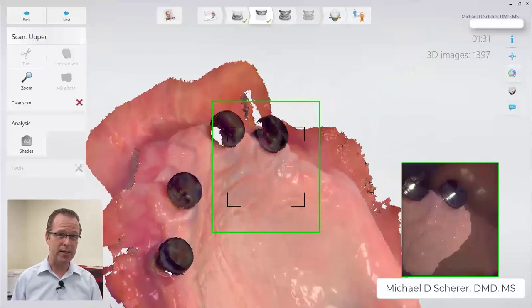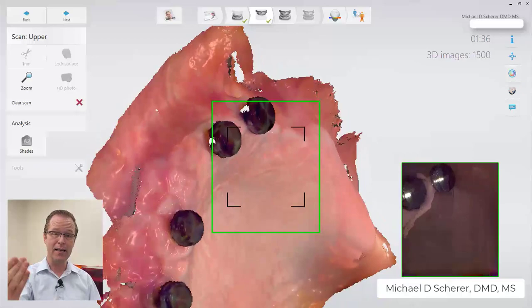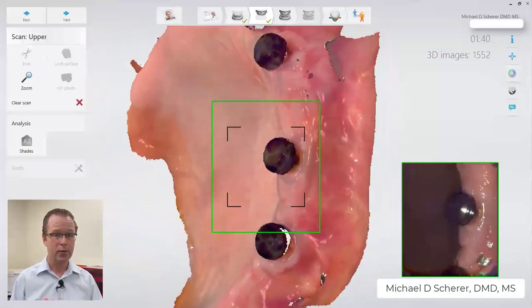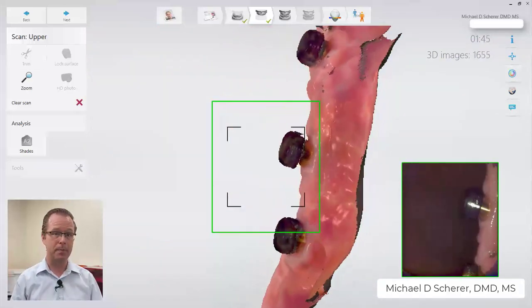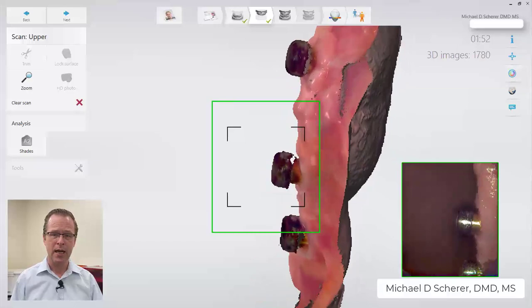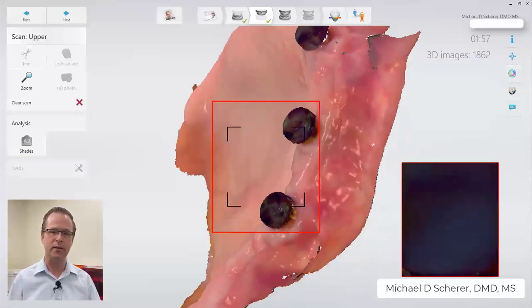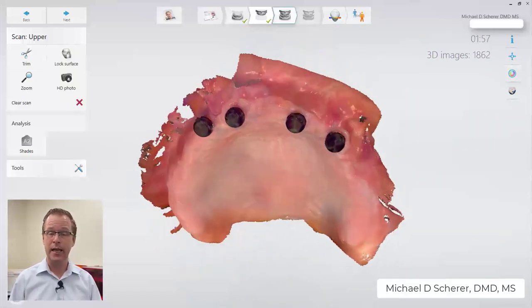These are the metal housings that you would use just in your denture. The nice thing about doing it this way is you'll provide the laboratory the exact position where the housings go. When the laboratory technician gets these scans back, they can build the proper spacing in around those housings for your locator pickup. I'm just going back and touching up some of the big voided areas to make sure the scanner doesn't delete everything. Overall you can see the quality of the final scan when completed, simply using the locator abutment housings.